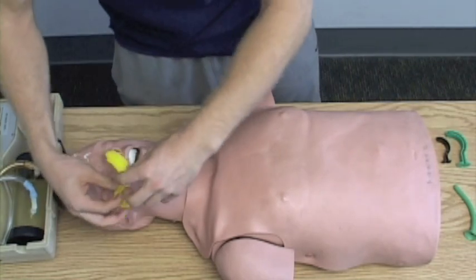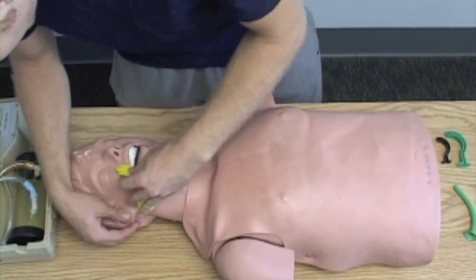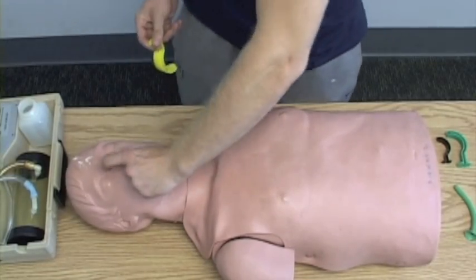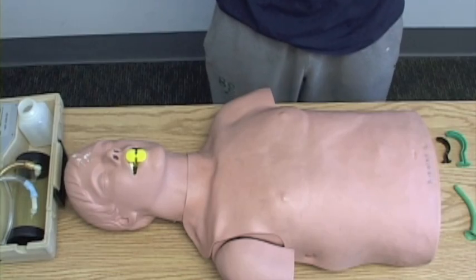I'm going to measure my OPA from the ear to the mouth. I'm going to open up using the cross thumb technique and insert it backwards and turn it 180 degrees. The patient's gagging — the patient has become conscious.